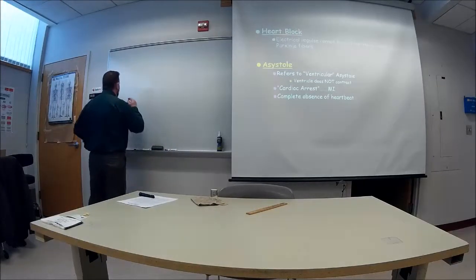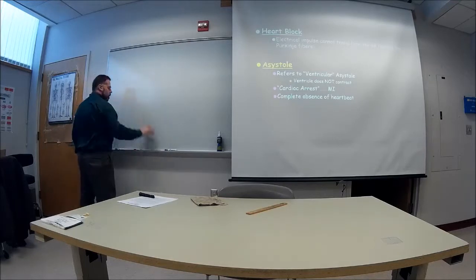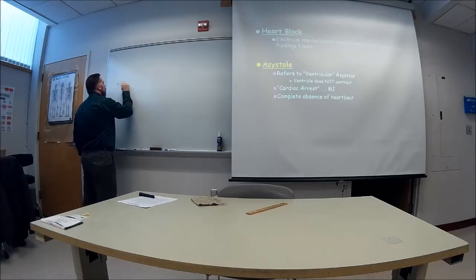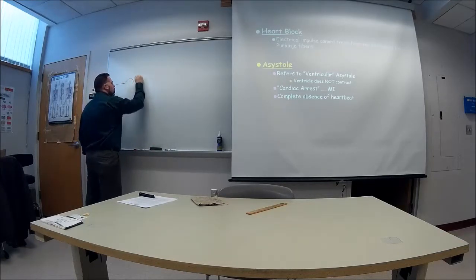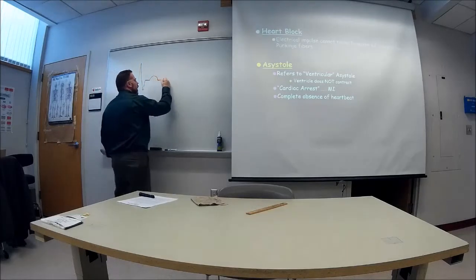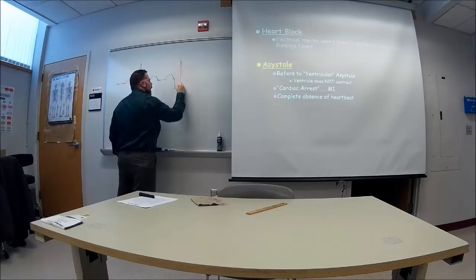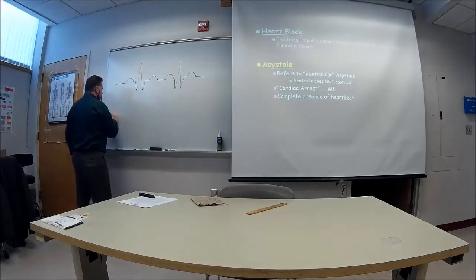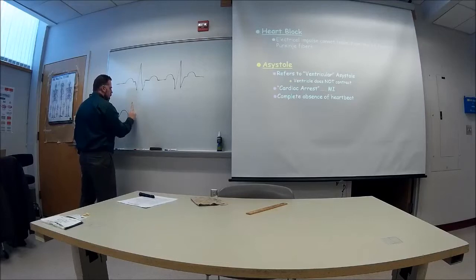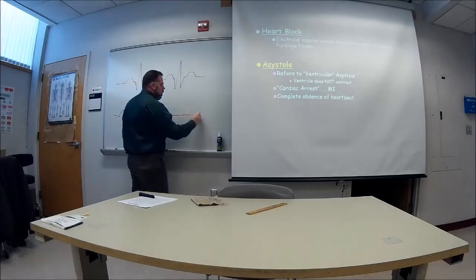What it looks like is normally you have P, Q, R, S, T, and then you have P, Q, R, S, T, and then all of a sudden, no contraction.